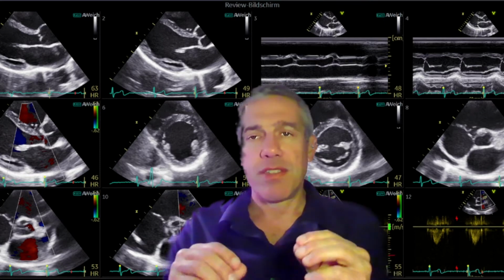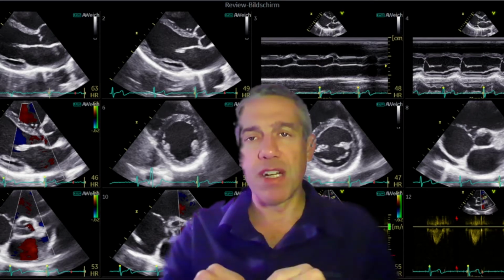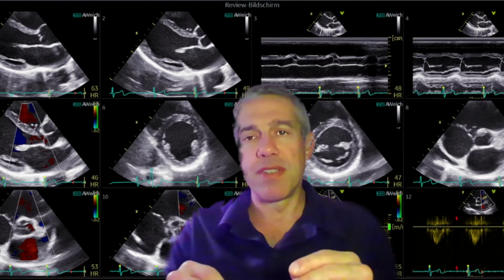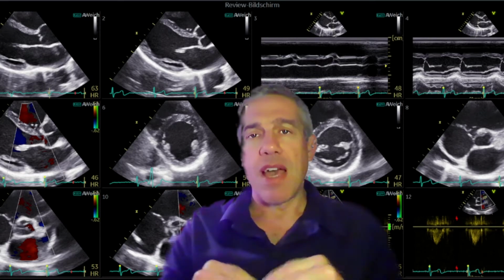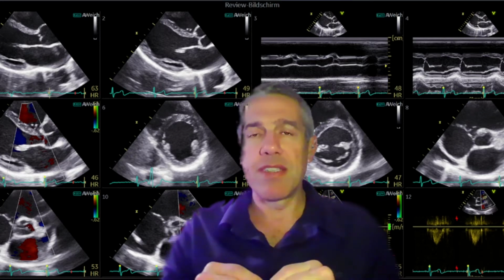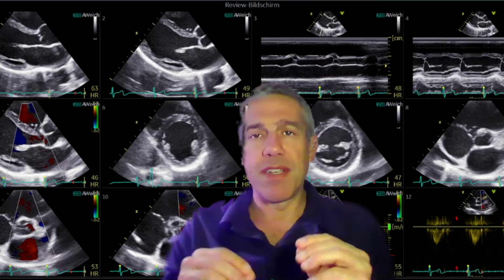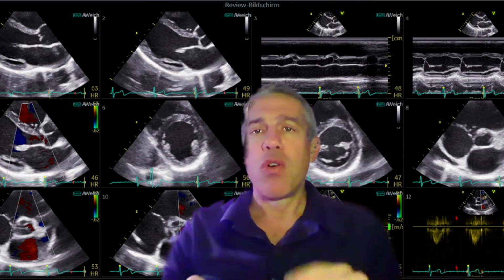He was in symptomatic heart failure, had dyspnea, New York Heart Association functional class 2 to 3, and had several hospitalizations due to heart failure in the last year previous to the implant. After the implant, he improved significantly. He was very happy with the device, and he had no further hospitalizations. When we saw him, as you will see later, he had a significant reverse remodeling with an ejection fraction which is now almost normal.